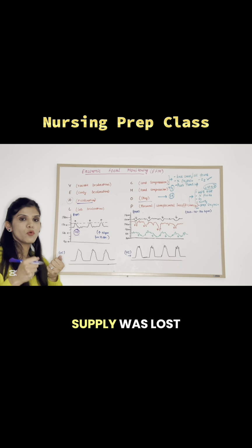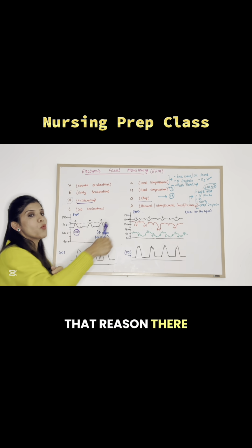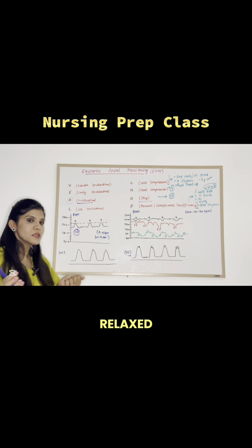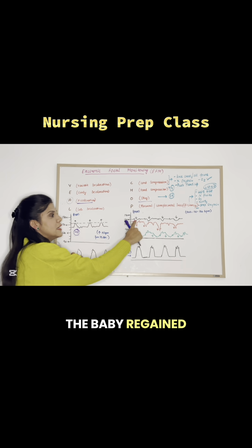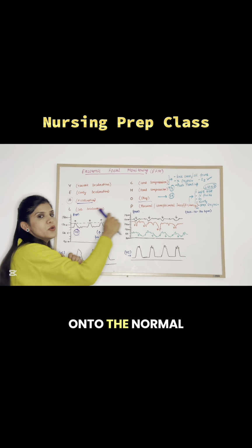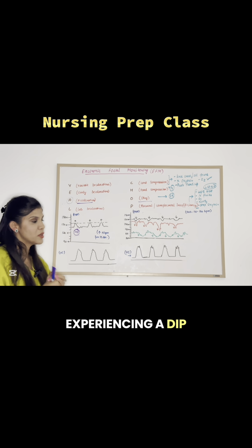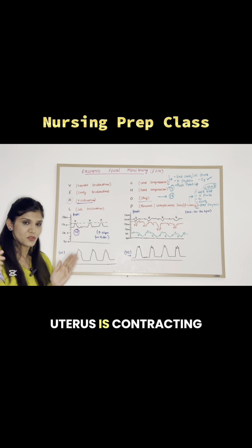So the blood supply was lost for a while, and due to that reason there was a dip in the heart rate. But as soon as the uterus relaxed, the blood supply resumed, and the baby regained his heart rate onto the normal baseline. So this is the reason that we are experiencing a dip. So in front of the uterine contractions, you will see a dip because the uterus is contracting.